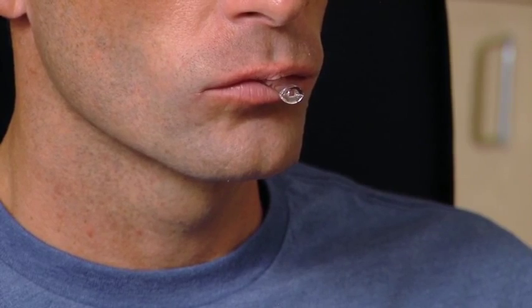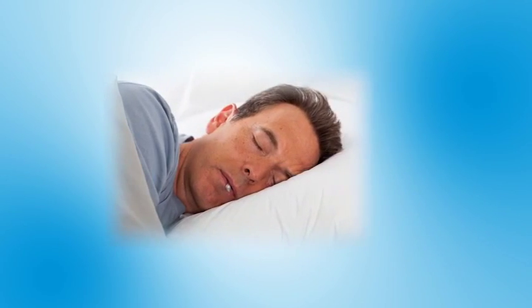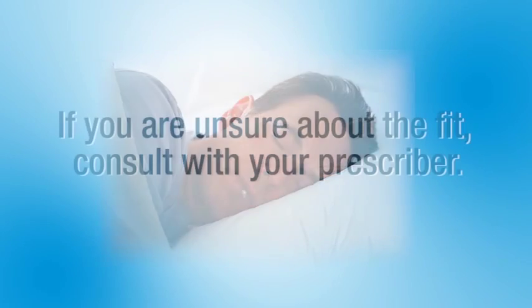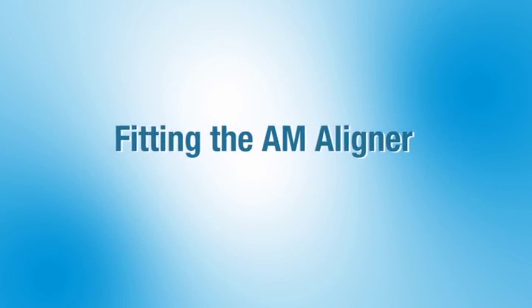If you have an implant, the tray may seem tight. 3 minutes after the initial fitting, take the tray out of the mouth and widen the area around the implant. This will reduce the pressure on the implant. Some users will experience a dry mouth or excessive salivation during the initial week of use. This will generally subside with time. If you are unsure about the fit, consult with your prescriber.